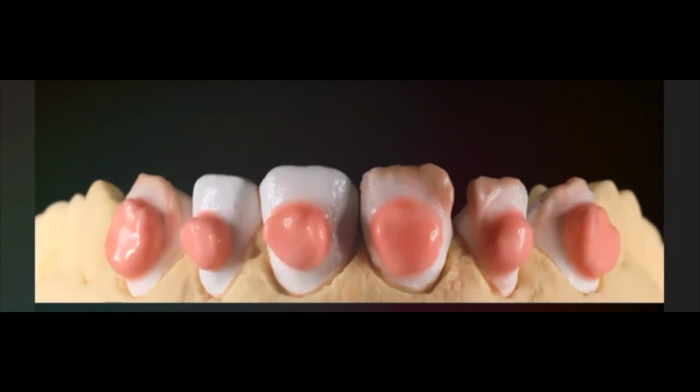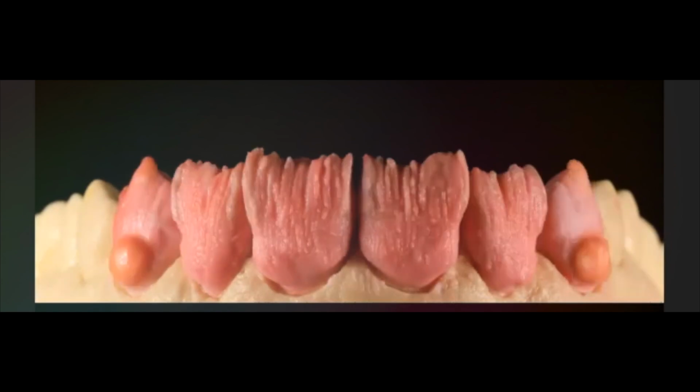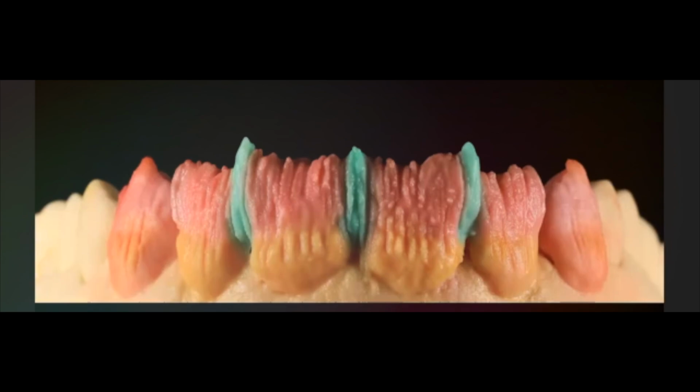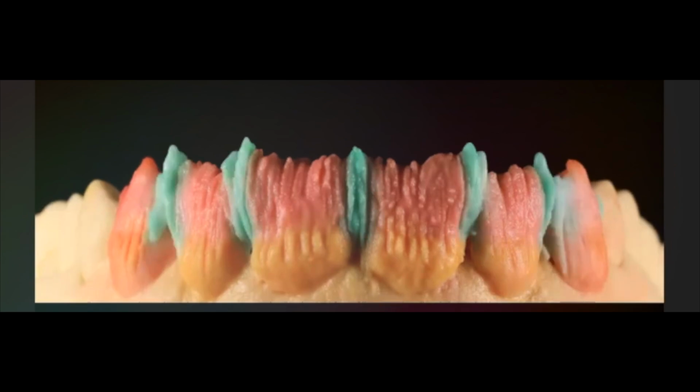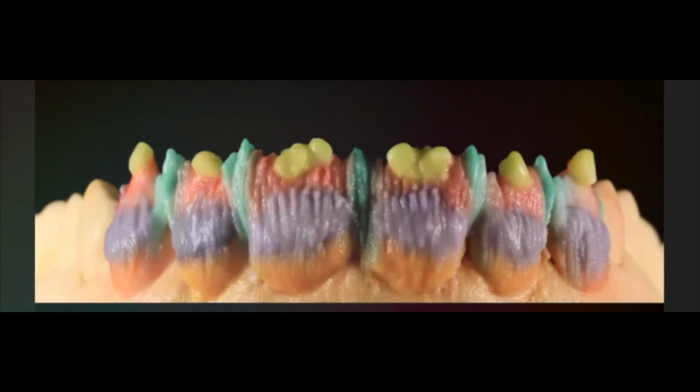We proceed with dentine, cut back of dentine, cervical translucent, and then bluish interproximal, opalescence in the middle in order to apply more illusion of depth, mamelons.